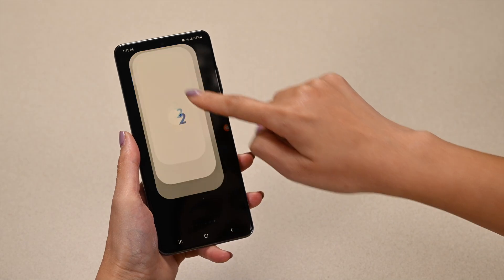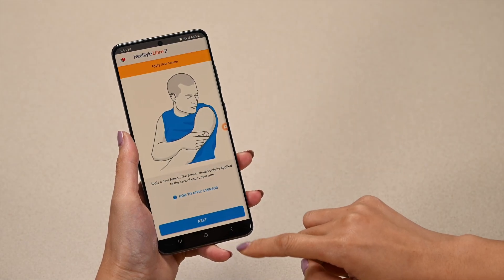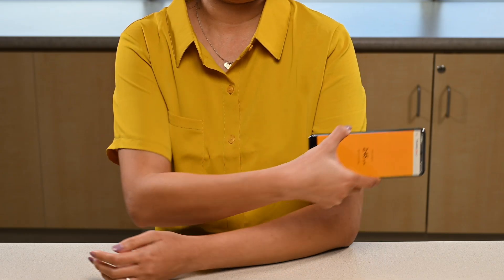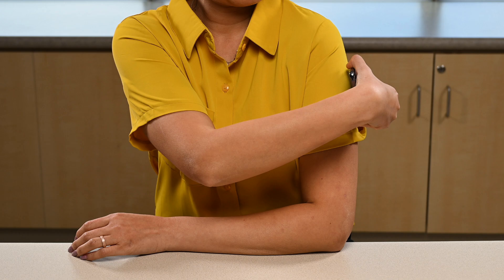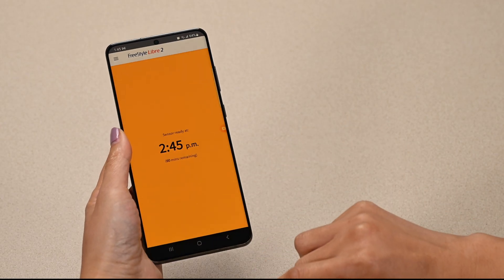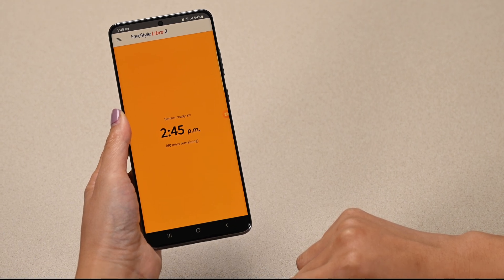If you have an Android phone, in the app, go to the home screen. Hold the back of your phone 1-2 inches from the sensor on your arm. You will hear two different beeps when the sensor has started. Your glucose readings will start one hour after starting the sensor. It takes 60 minutes to calibrate a new sensor.